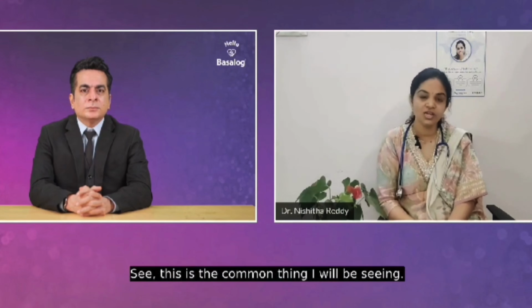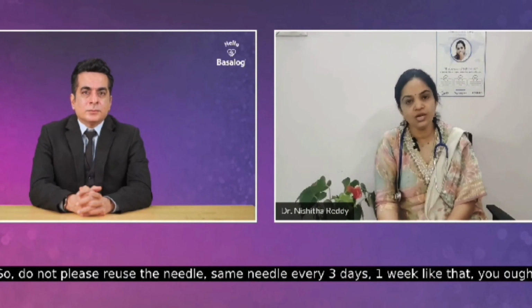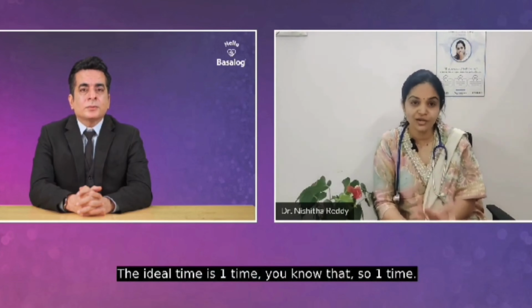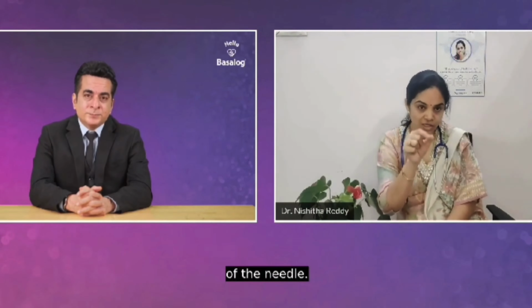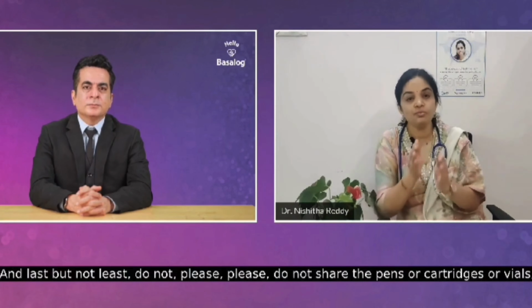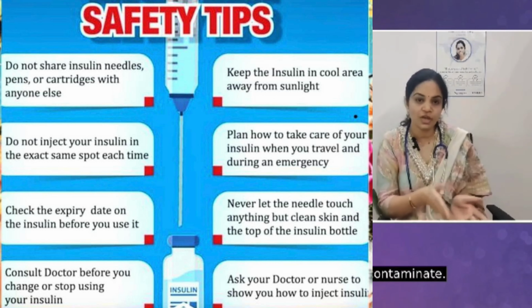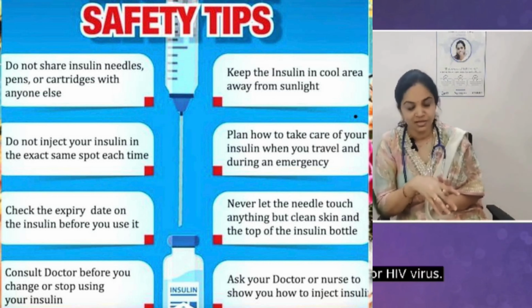Coming to reuse of the needle, this is a common thing I see. Please don't reuse the same needle every 3 days, 1 week, like that. Whatever syringe or needle, the ideal use is 1 time. What happens if you reuse the same needle? It will damage the tip of the needle, so it may cause injection site pain or bleeding, or fragments may lodge under the skin. And last but not least, please don't share syringes or pens with your neighbors or other family members, because you may get contaminated with hepatitis B or HIV virus.